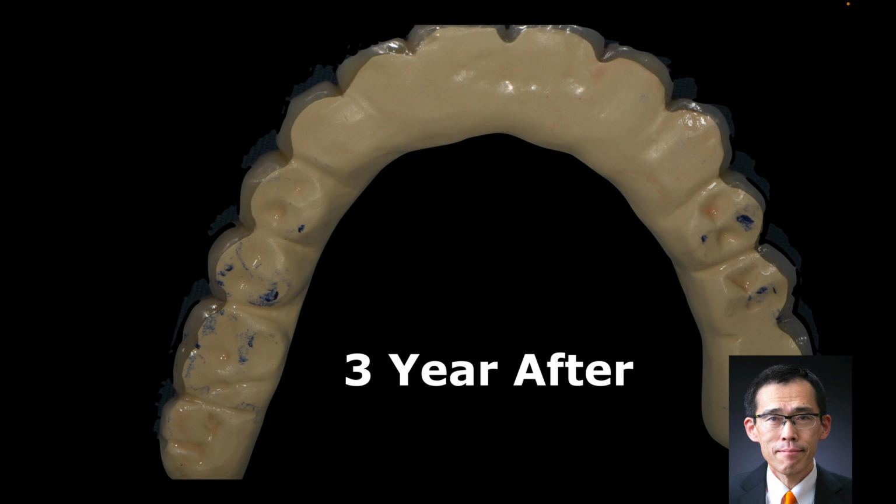In this case, we can confirm slight wear on the occlusal surface, and we recommend this prosthesis because of good cleansability. This prosthesis is ideal in a super-aging society because of the need for nursing care.